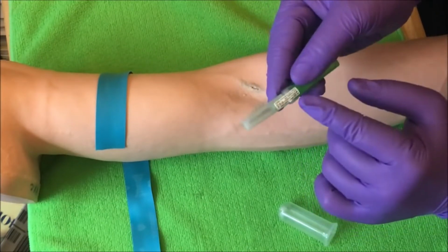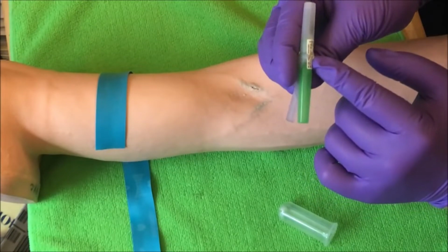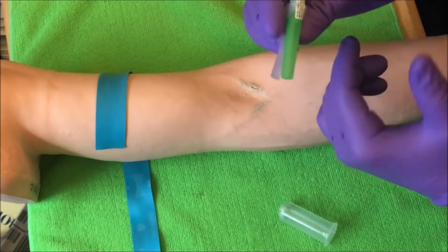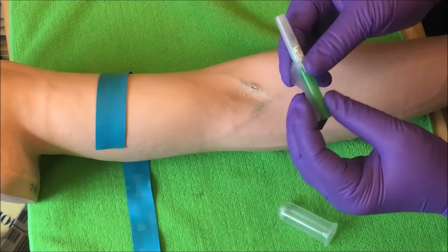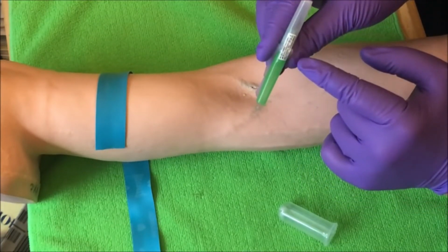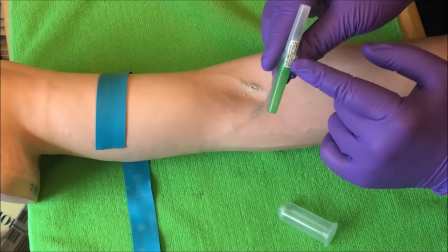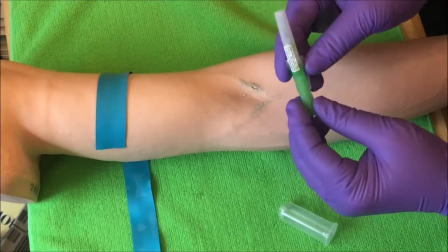Now, every needle has the gauge, and it tells you on there, if you're not sure, it'll tell you on the sticker here if it's a 21 gauge or a 22 gauge straight needle. Typically, you're going to find only 21 and 22s in labs and hospitals, but the most preferred needle to use on any venipuncture is a 21 gauge needle. So if you see that on an exam, the most preferred needle, it's 21 gauge always.